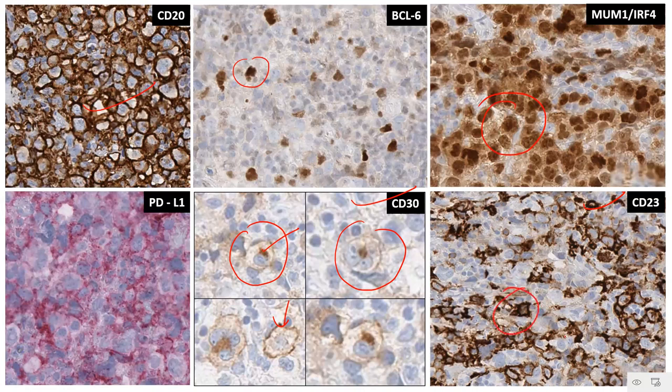CD23 also seems to be positive in some of these large cells. So these immunophenotypic markers like CD30, CD23, if expressed within the context of a large cell neoplasm in the mediastinum, would favor a diagnosis of primary mediastinal B-cell lymphoma if you have that histological suspicion in mind. PD-L1, again, is another marker which adds strong weightage to the possibility of it being a primary mediastinal B-cell lymphoma.